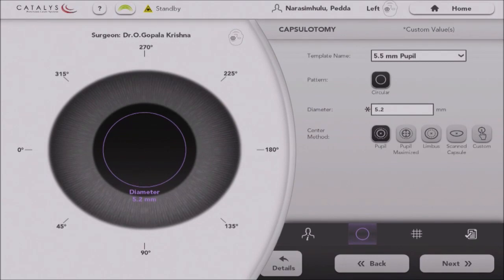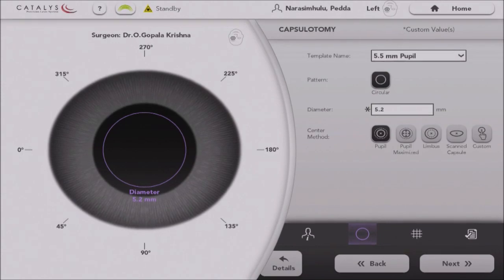Sometimes you will do 6 mm; sometimes you can plan for 5.2 mm. In this case, I am trying to do a 5.2 mm capsulotomy. There are 5 different methods of making a capsulotomy here: pupil centric, pupil maximized, and others. If you want to make it pupil centric, that's one option. The second option is to make the capsulotomy parallel to the limbus.